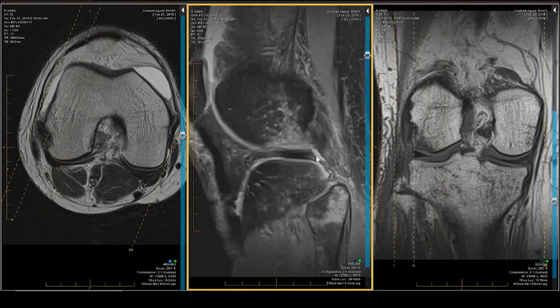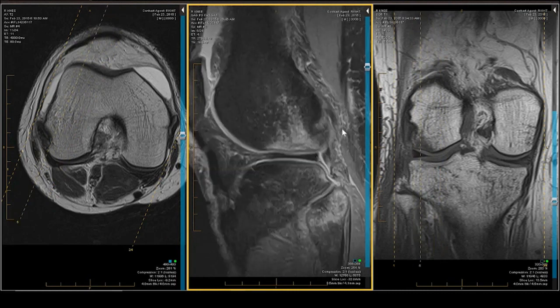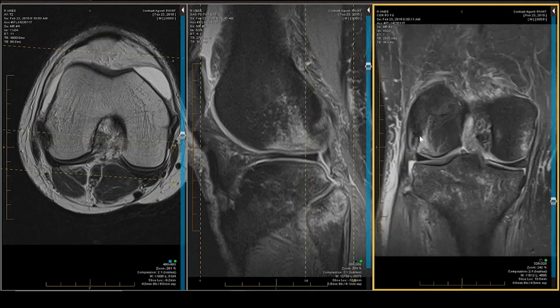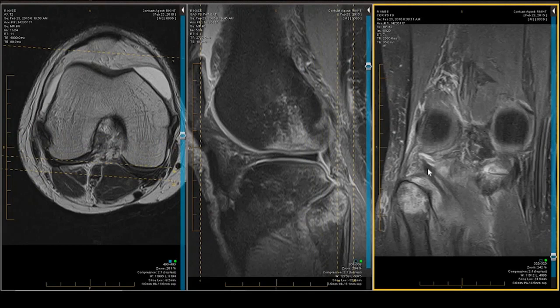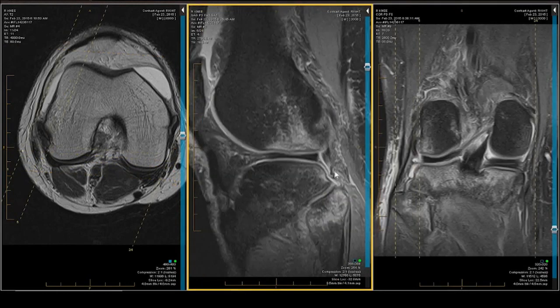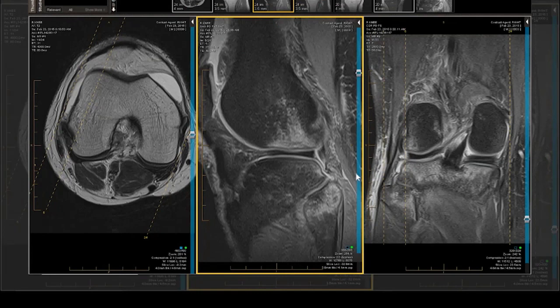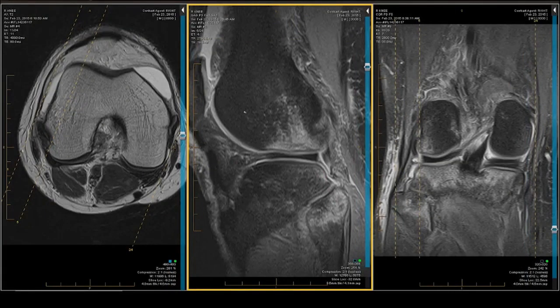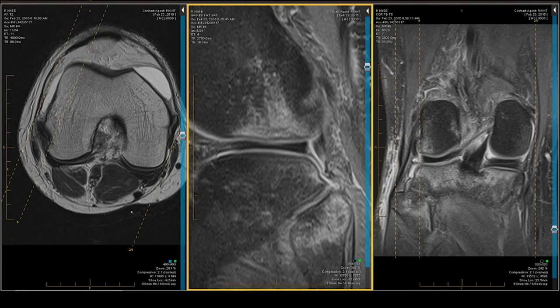Now let's look at the popliteofibular ligament and popliteus tendon, best seen coronally. In the hiatus, we follow its arcuate course as it plunges anteriorly and medially — the popliteus is intact. However, the popliteofibular ligament is swollen, ill-defined, and demonstrates the mermaid sign: here is the body of the mermaid and the mermaid's tail. This represents a high-grade popliteofibular ligament tear.